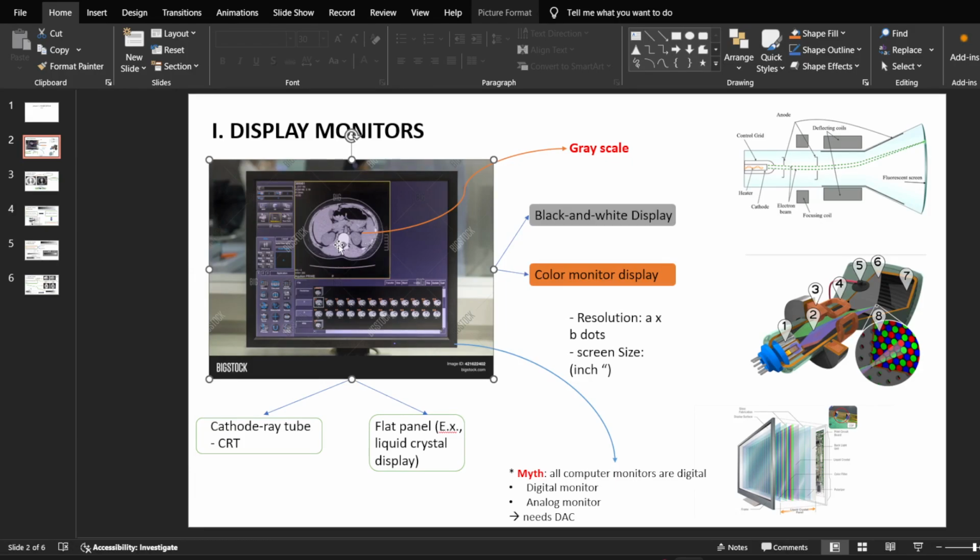So if you want a better image quality, your monitor needs a high resolution configuration. From that point, you would have a great grayscale display of your screen. All right, display monitor, my friend, just an introduction. Right now, let's come to the great part.